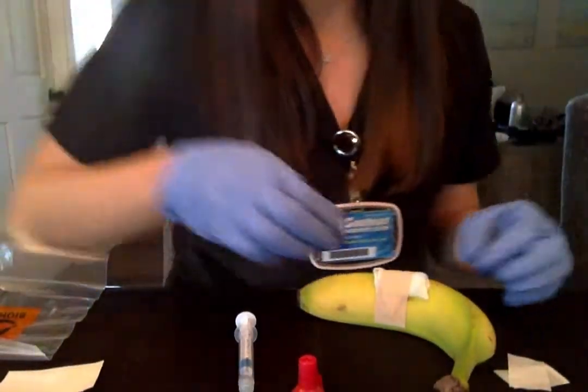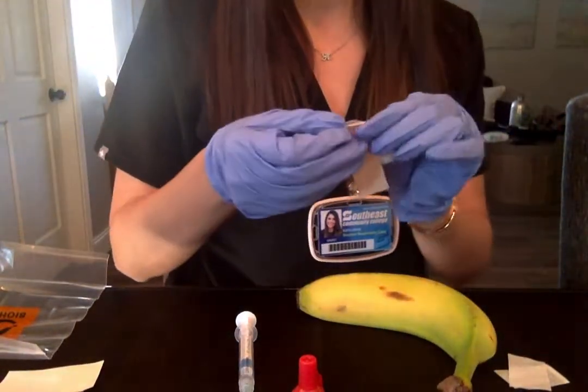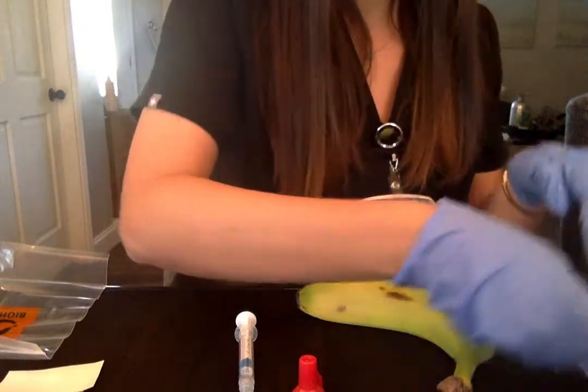So I have gathered my equipment here and I'm ready to go.